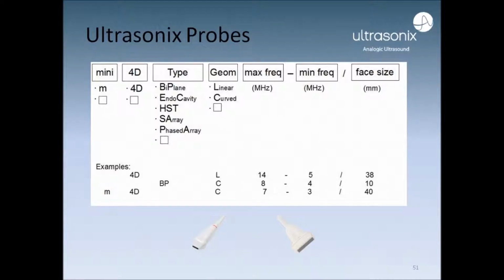In the next few slides, I'll talk a little bit about Ultrasonix transducers. Note that Ultrasonix does not manufacture its own transducers and that we purchase our transducers from third-party OEMs. Therefore, some of the information related to our probes are proprietary to our OEM suppliers.